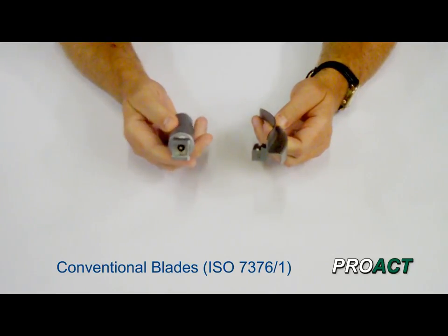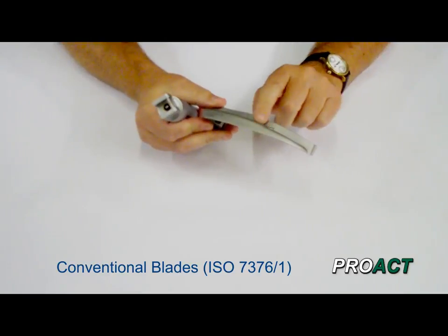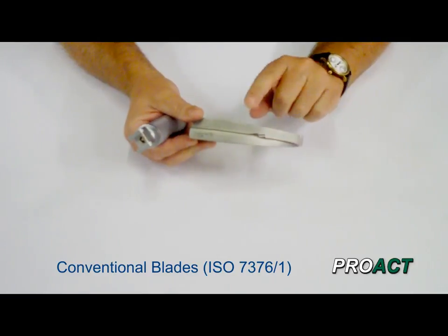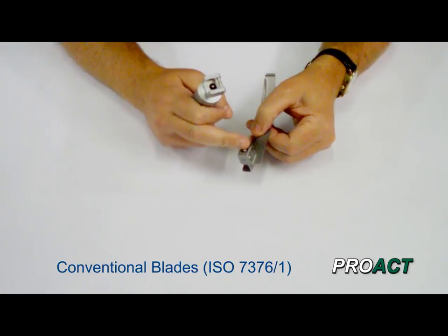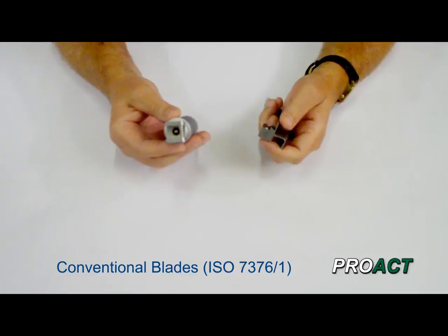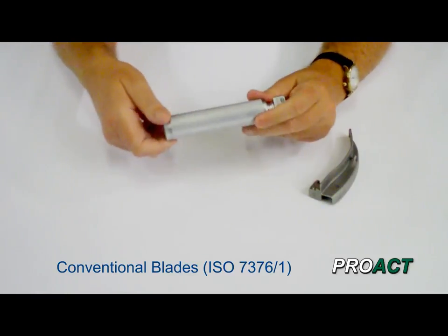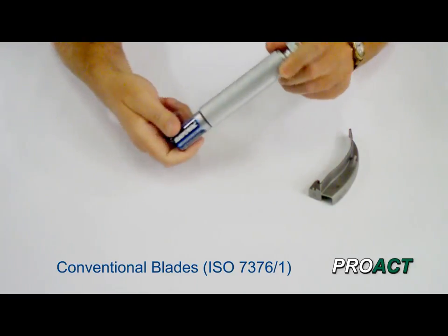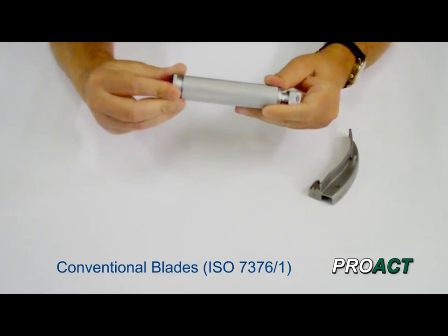First of all I'm going to start off with the conventional system. The conventional system is ISO 7376 part 1. This means that the light source is in the blade itself. Here's the laryngoscope blade, here's the light source, and to get the power to the light source there needs to be electrics which come through this contact here. So the handle itself is essentially just an electrical supply holding the batteries — the batteries are inside here.